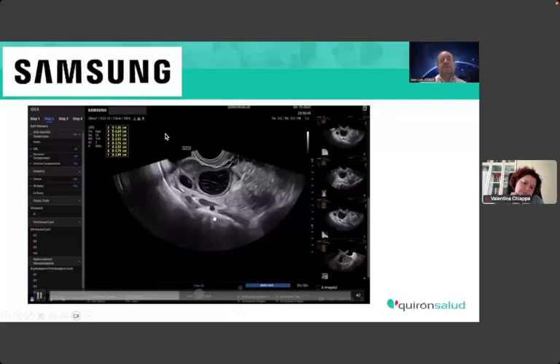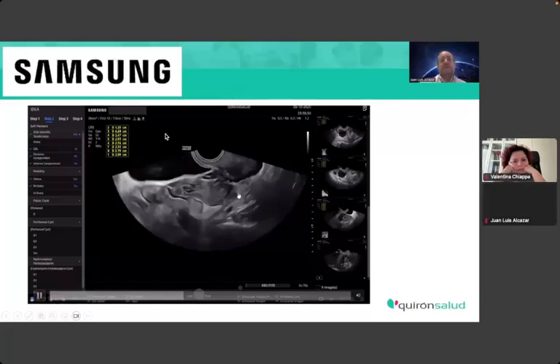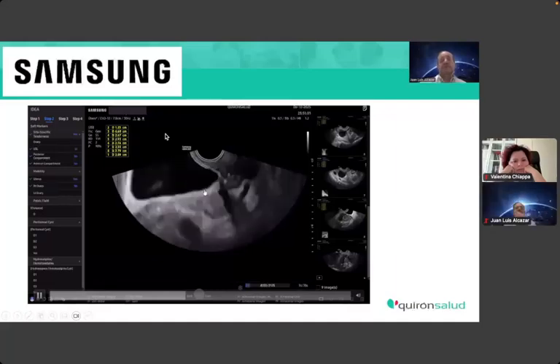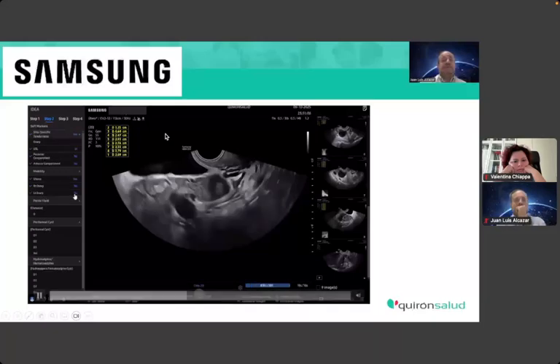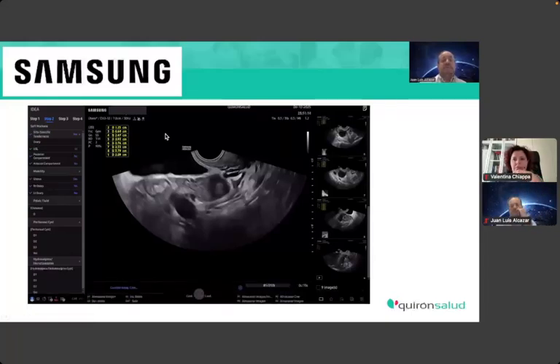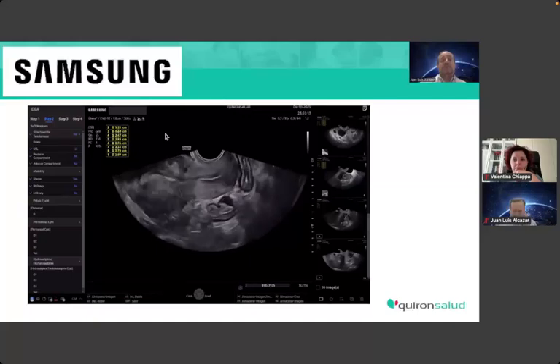and then you look for the left ovary in this case, in this example, and you assess the same. So the ovary is here, and then you go to the left ovary, try to look for the movement, the sliding, actually, mobility of the ovary right there, and then you establish whether the ovary is mobile or not. You see, in this case, we consider that both ovaries were not mobile, which is a soft marker of the presence of endometriosis in the pelvis.